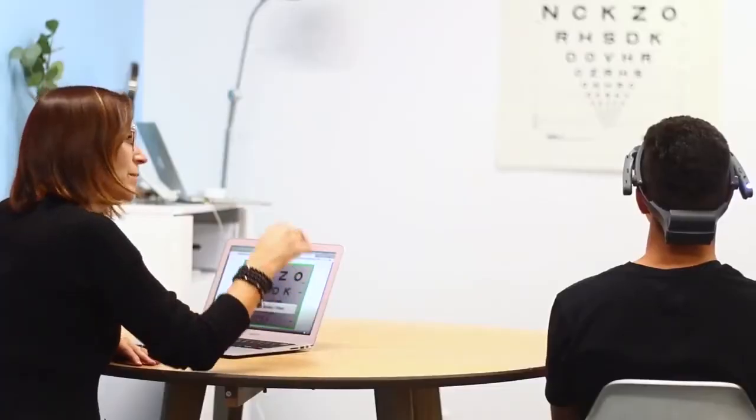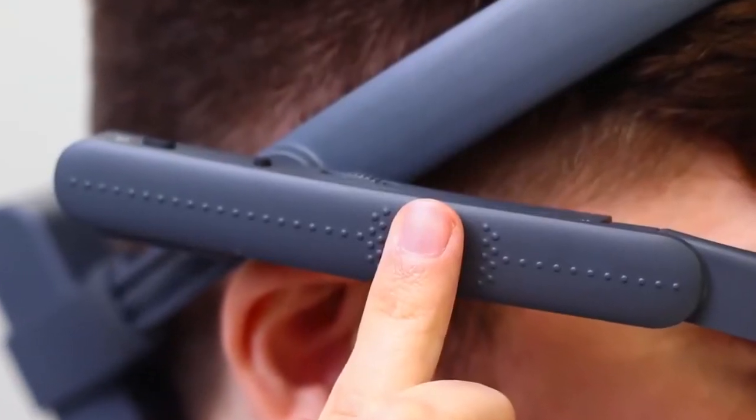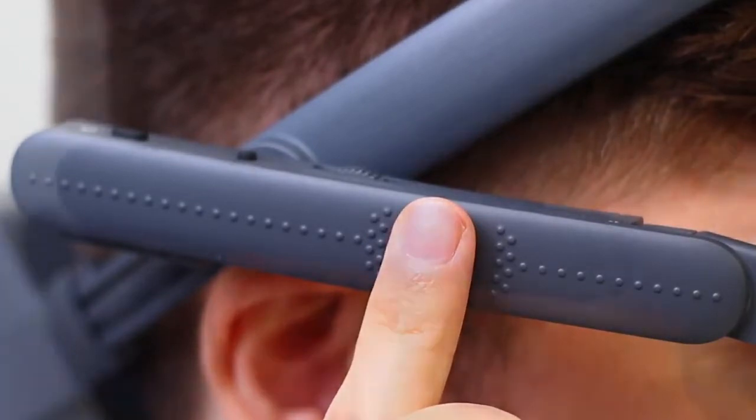Using the Secure Shared Account feature, the computer screen shows exactly what is displayed on the headset. Now let's start with the vision controls integrated into the headset. For some users, it's all they need.